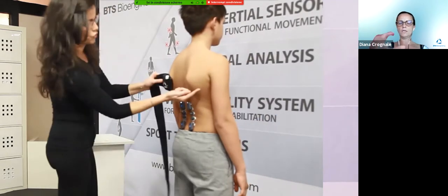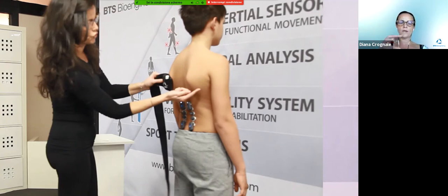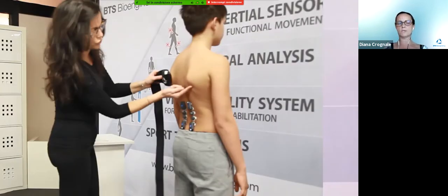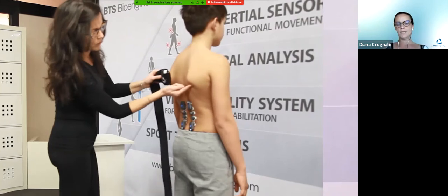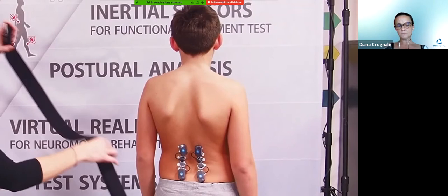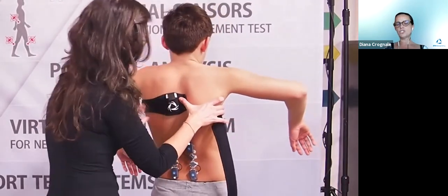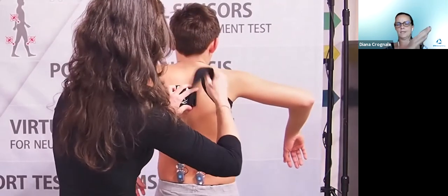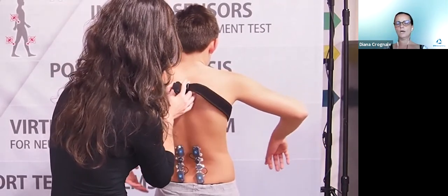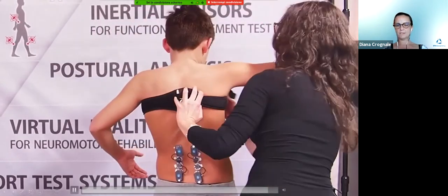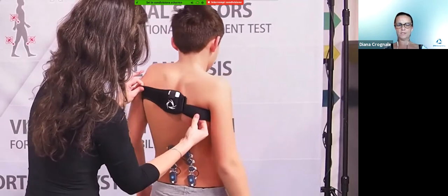We are working with the higher probes around the L1-L2 level and the lower probes at the L4-L5 level. In this case, our G-sensor has to be placed higher, exactly near the line of the scapula, because thanks to the G-sensor we can define the flexion-extension angle of the trunk. How to perform the test was shown in the previous video.